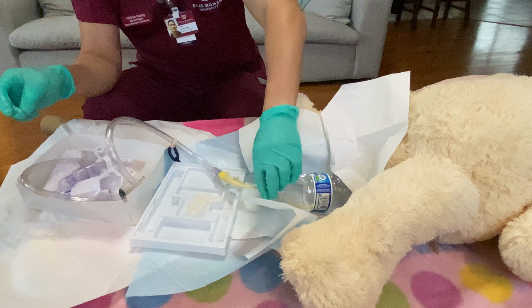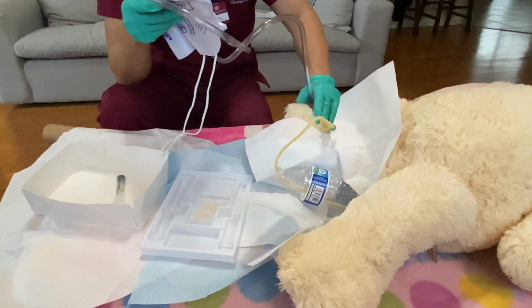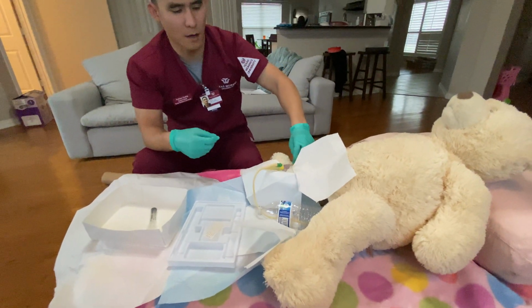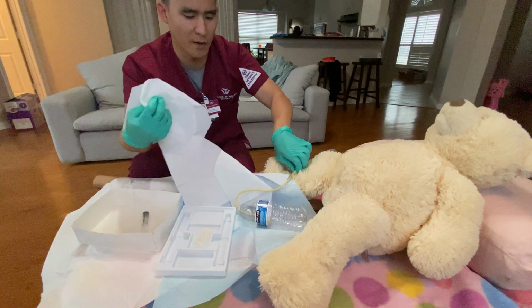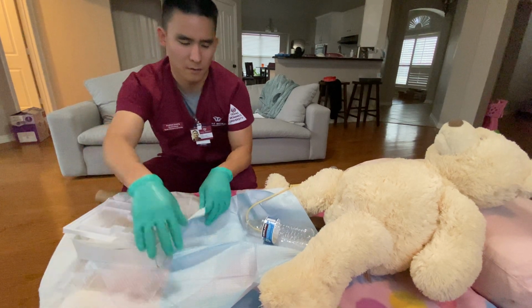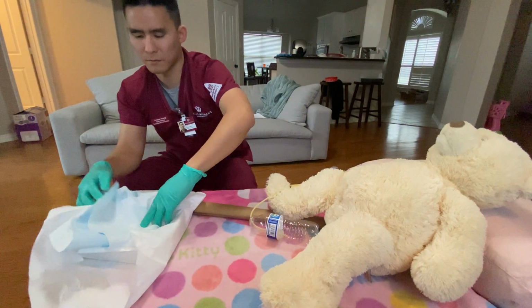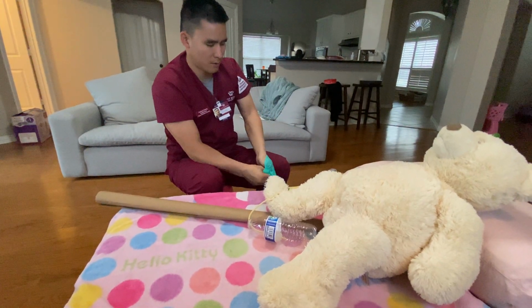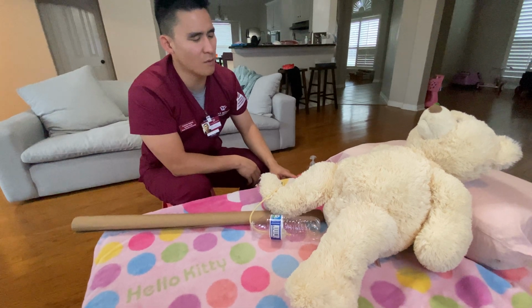So now I'm going to attach the catheter to the patient's thigh with some tape. And then I'm going to hang the catheter on the bed frame. Now I'm going to do a little cleanup here. There we go. I'm going to remove my gloves. And now I'm going to reposition your bed, get you to a good comfortable working height, or back to where you were before.